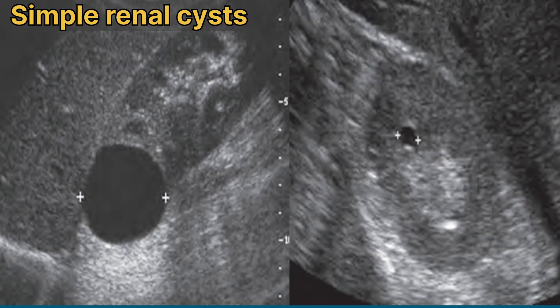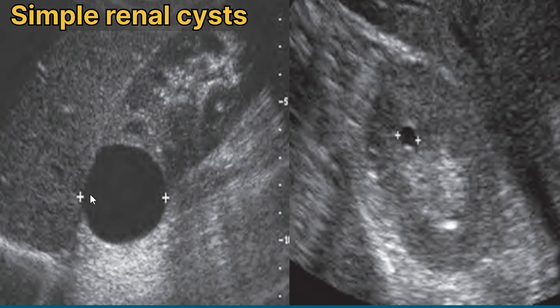Now we are going to discuss renal cysts. The accumulation of fluid within a thin membrane of the kidney is called a renal cyst. On ultrasound, cysts show characteristics including an anechoic lumen, well-defined back wall, acoustic enhancement deep to the lesion, and no variable wall thickness. This round structure demonstrates an anechoic lumen with acoustic enhancement and normal wall thickness — a simple cortical cyst at the upper pole of the kidney. A small cyst is also present with the same features.